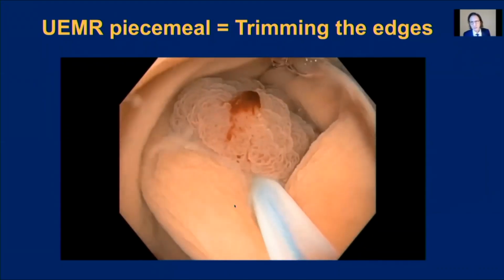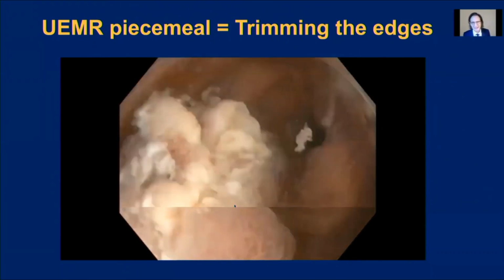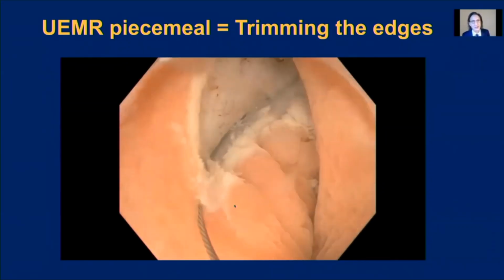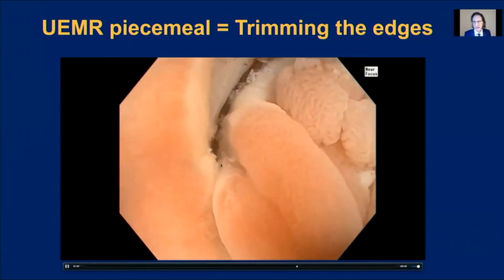And when we perform this underwater, now this is with saline, we always use saline, we also get the heat sink effect, which limits the depth of injury. But you can see here there is some residual on the side. So this is the trimming that we do afterwards.